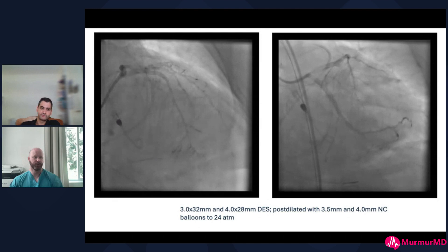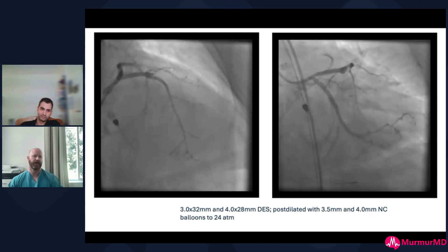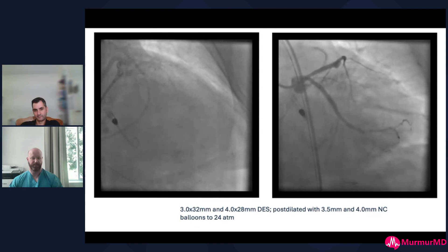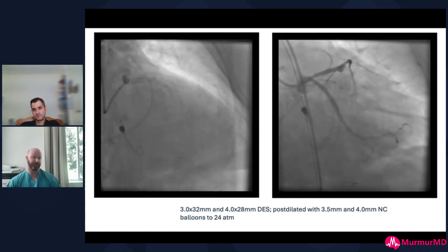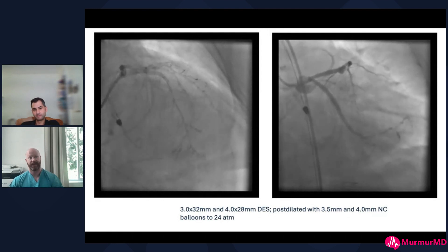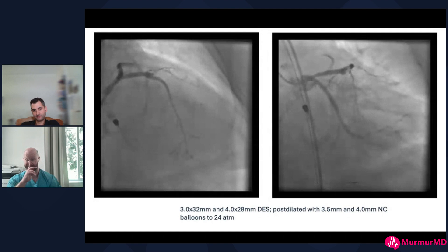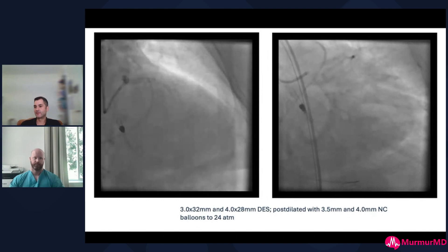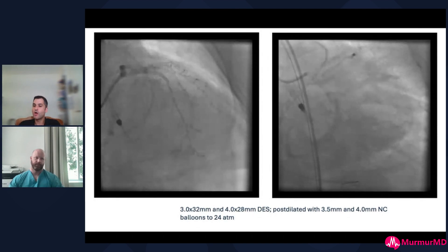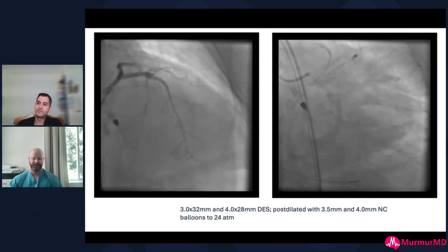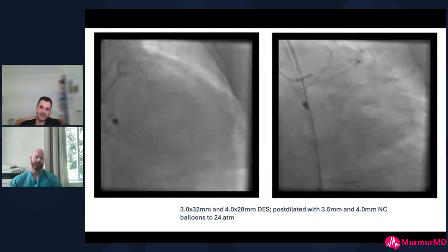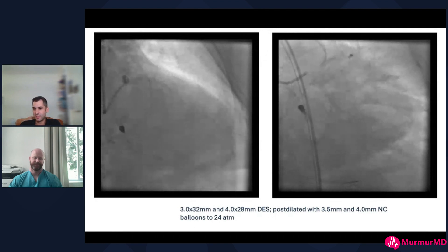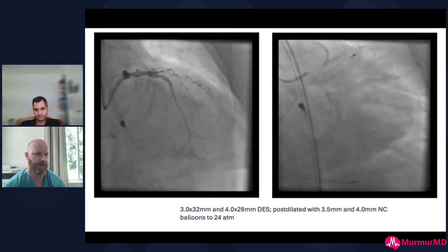This is a good example of how with the right tools — a Wiggle wire, a guide extension — you can do calcium modification without necessarily using atherectomy. While it might have made delivery a little faster, it certainly could have complicated things with the hemodynamics. IVL can cause hemodynamic disturbance only really through balloon occlusion — if you deflate the balloon they should recover. If we had done atherectomy and had no-reflow even with the Impella, that may have been a CPR situation. So you don't necessarily have to do atherectomy, especially if the hemodynamics are going to give you a lot of grief.